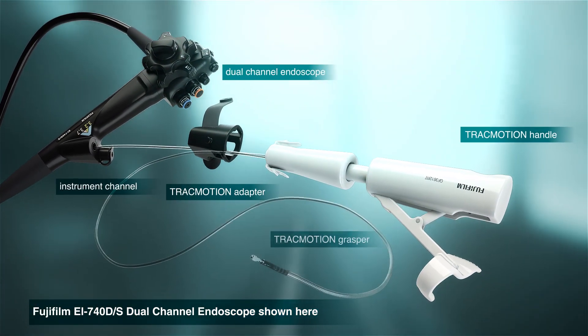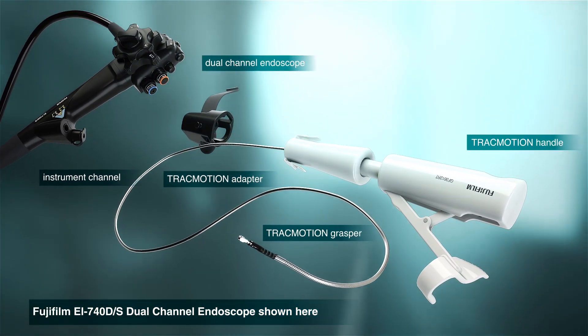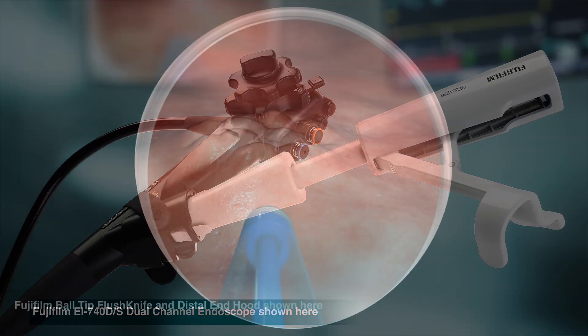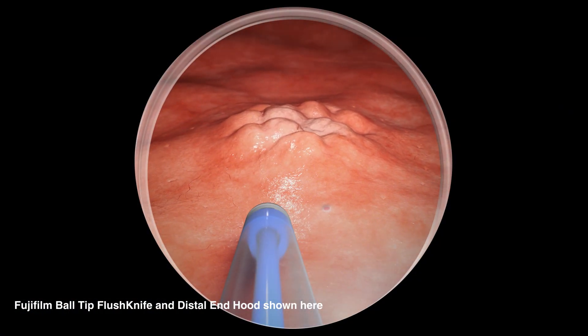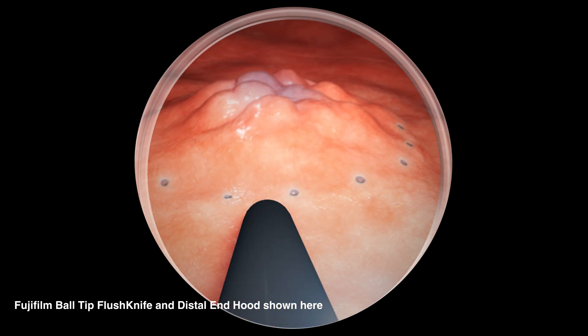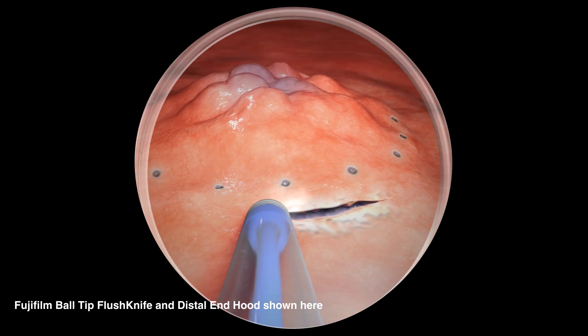Once a lesion is located, Track Motion attaches easily to the dual-channel endoscope and is passed through the instrument channel. The lesion is marked with an ESD knife and injected with lifting agent. Then, an initial cut is made with the knife.